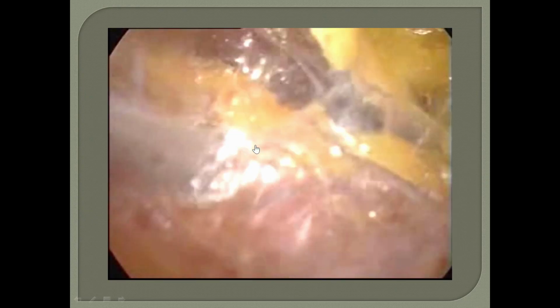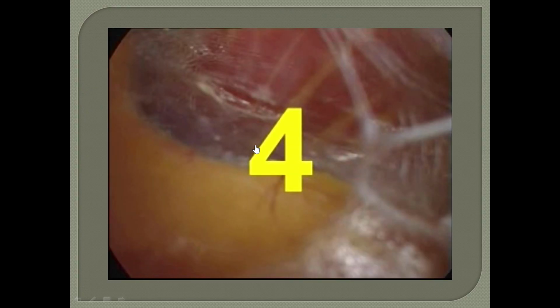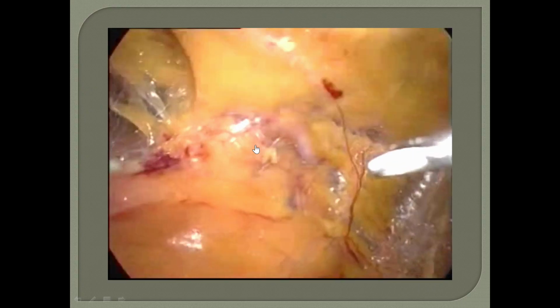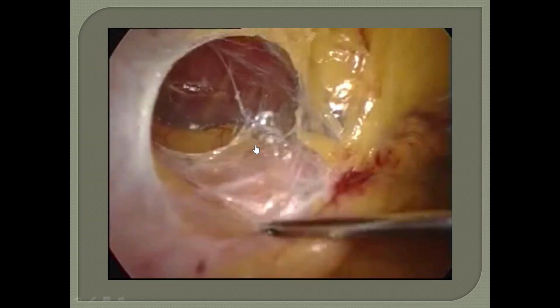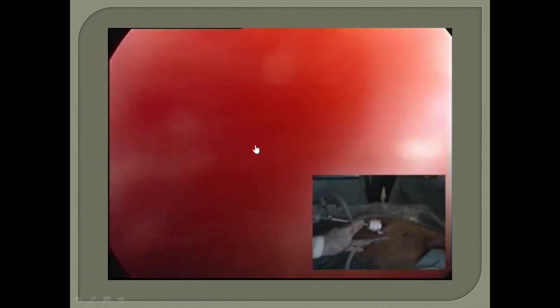And then what is important is to go at least at 90 degrees to free and to release totally the peritoneum pouch. So you see this attachment, okay? And now you go and you follow this part. You see the epigastric. You have to enlarge, because here it will be important for two things.